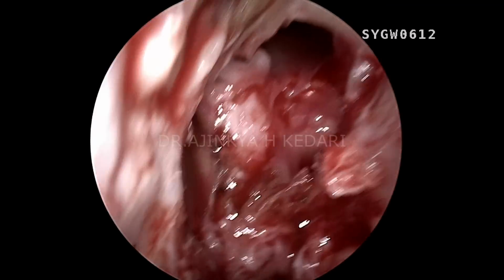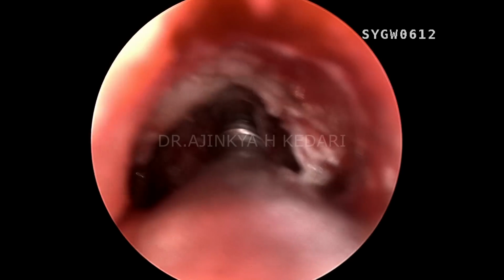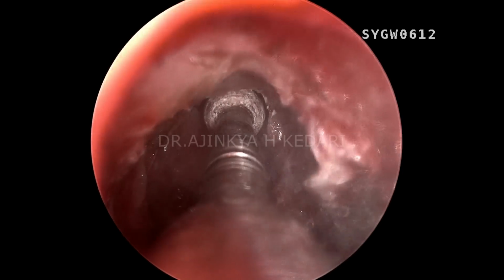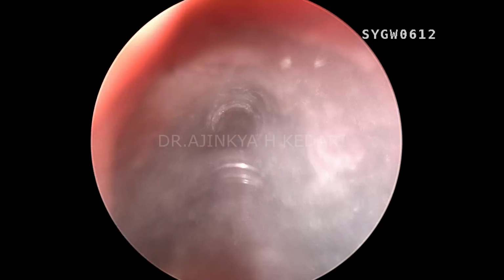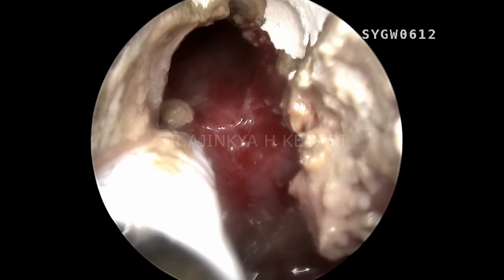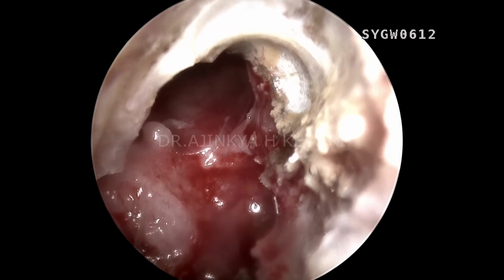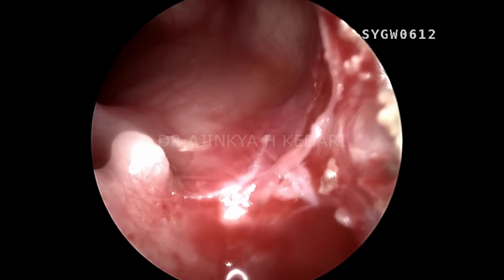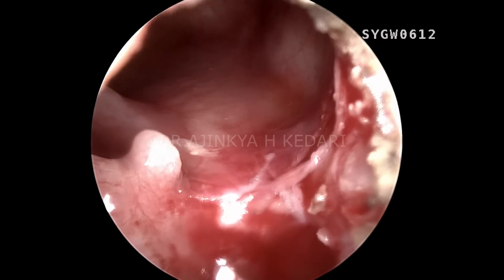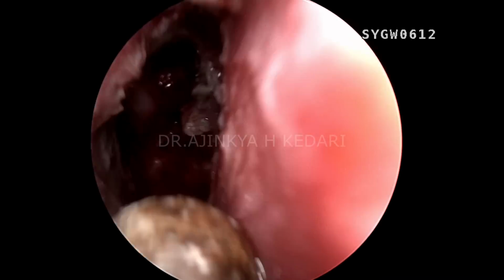That could be because of the previous road traffic accident, or it could be because of the transcranial intervention done. So you can see I'm trying to drill away all that frontal beak anterior superiorly till I reach the skin superiorly. That's the skin at your 9 o'clock, and I can see the roof of the frontal sinus superiorly as such. So that's the upper half of the frontal sinus. You can see very clearly right now the entire frontal sinus. This is a huge one on the right side.